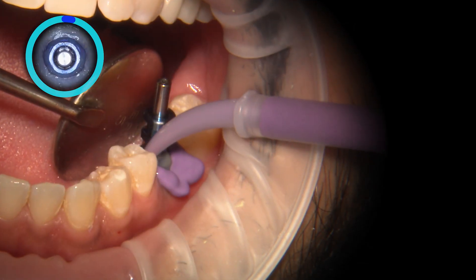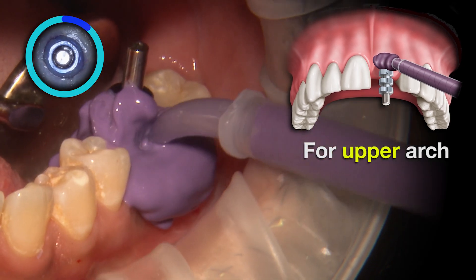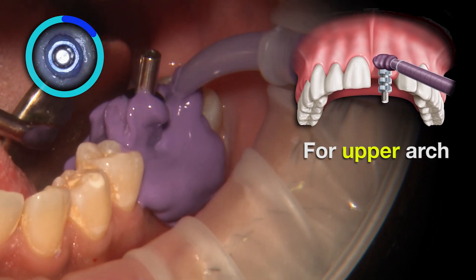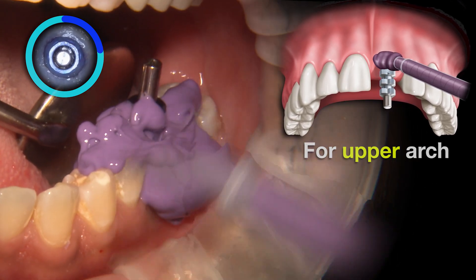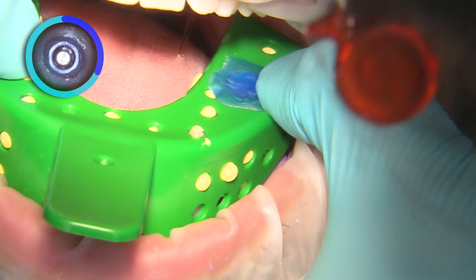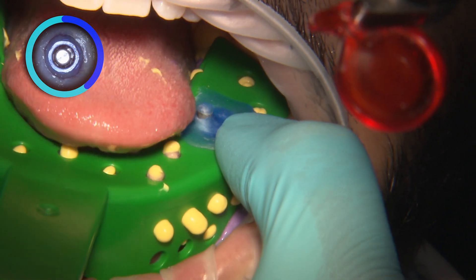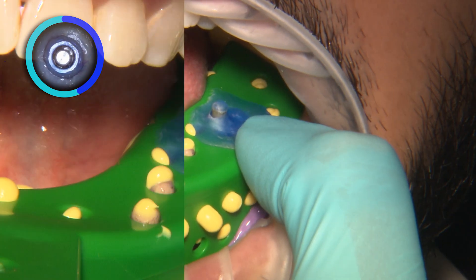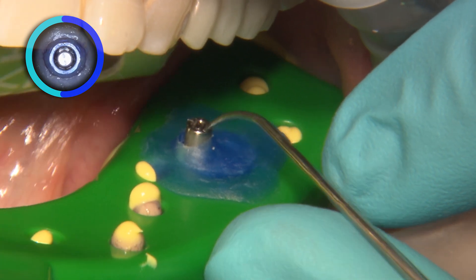Now we are ready for our impression. Just as with the previous technique, a lighter viscosity PVS material is syringed intraorally around the soft tissue and adjacent teeth, while the tray is filled with a heavier viscosity PVS. Keep in mind, for an open tray technique, either a polyvinyl siloxane or polyether material can be utilized. Polyether is much more rigid compared to polyvinyl siloxane, so be sure to mind any undercuts that are present in the arch when using this material.